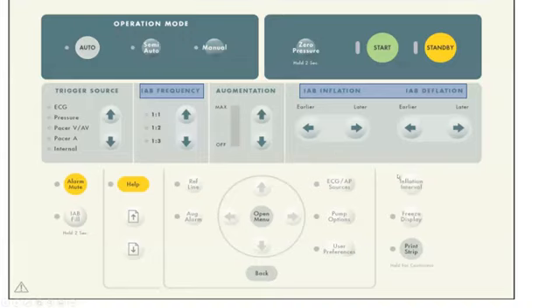But to make those adjustments, usually when you connect the balloon pump, you click on start and it will be on auto mode. If you want to make adjustments, you have to click semi-auto mode and click start again. If you click semi-auto mode, the balloon pump just stops inflating. So you click semi-auto mode, you click start, then you go 1 to 2, 1 to 3, or you make adjustments to the inflation deflation timing.